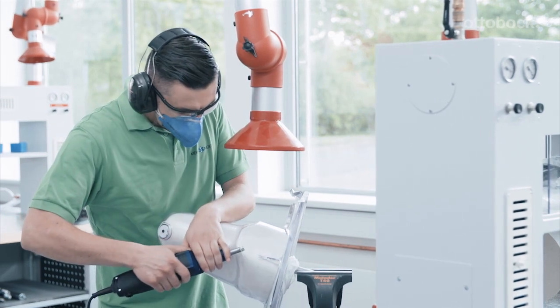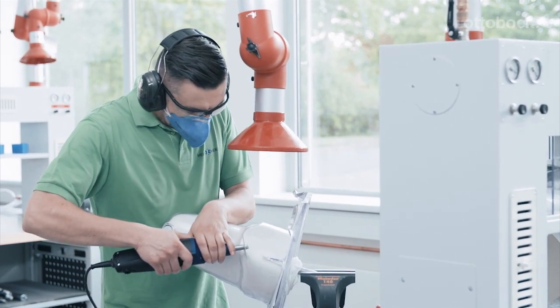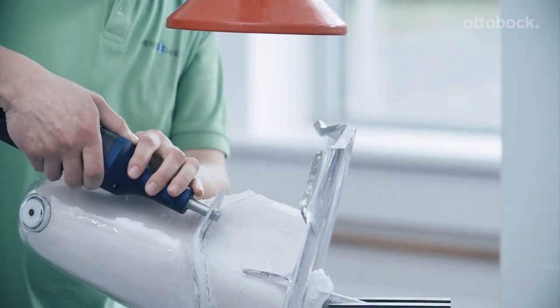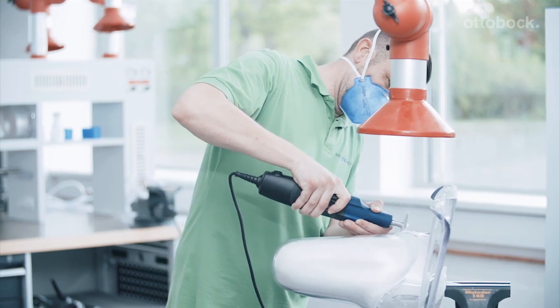Once the material has cooled, the socket is cut out. But be careful — the material is heat sensitive and can be deformed during cutting if you remain at the same spot for too long.